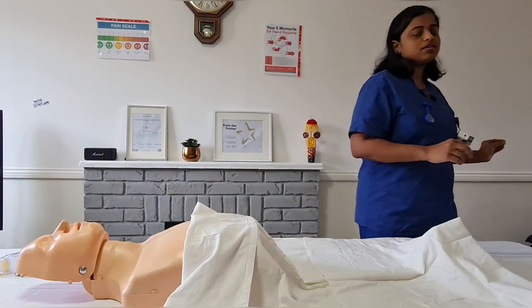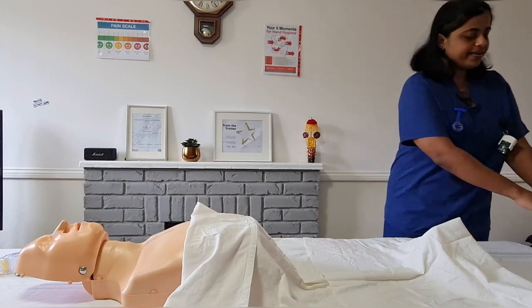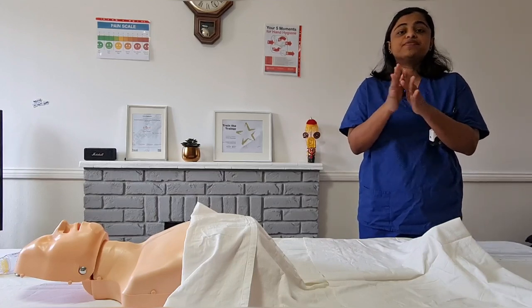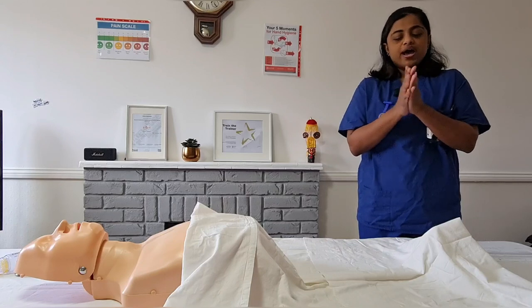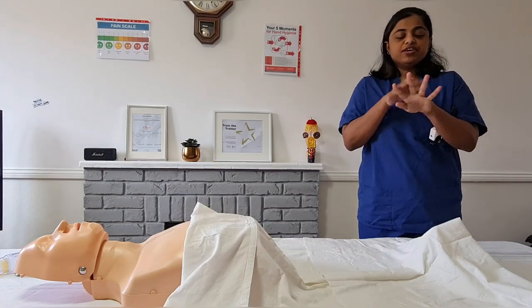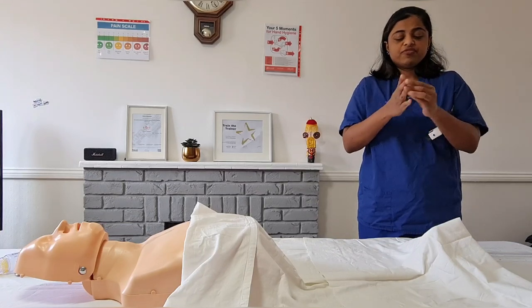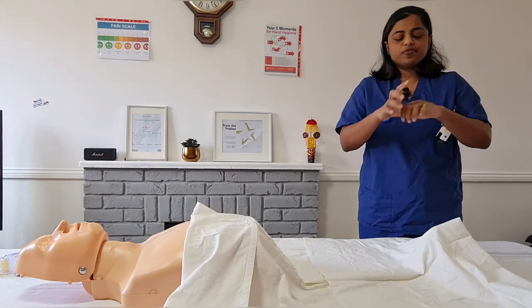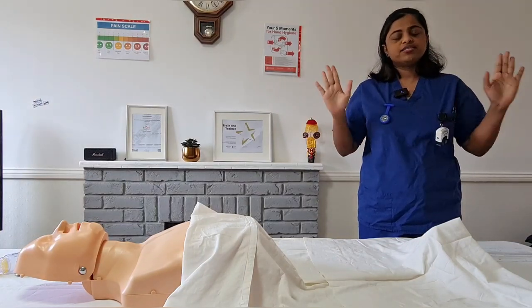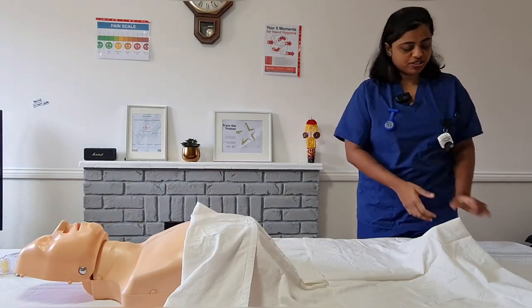As with every other station, we start with the pre-check buttons to provide privacy and dignity for the patient. Next I will do the seven-step hand wash as per the WHO guidelines: hand to hand, back of the hand, interlacing the fingers, interlocking the fingers, tips of the fingers, left thumb, right thumb, left wrist, right wrist, and wait 30 seconds to dry. My hands are clean, dry, and safe to approach the patient.